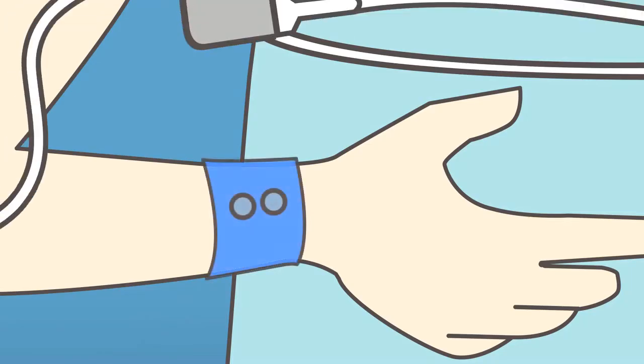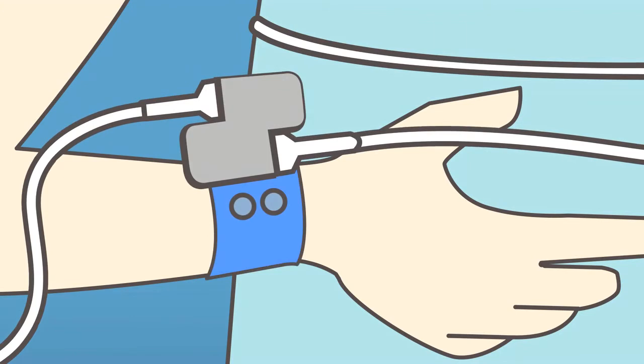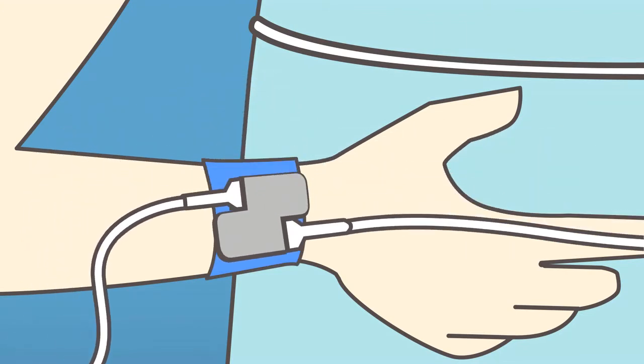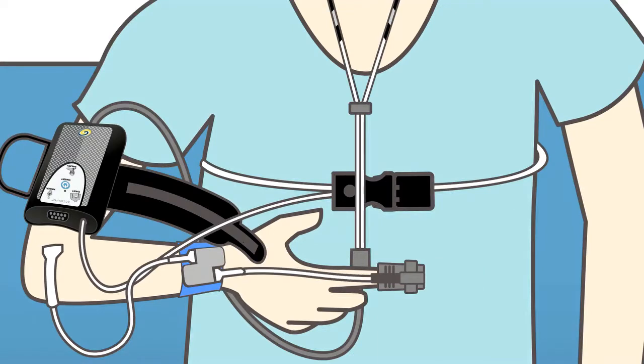Snap the chain of custody pod to the wrist bracelet that was put on by the clinician at your clinic. Place the finger sensor on any finger and plug the other wire of the chain of custody pod to the Accusom.